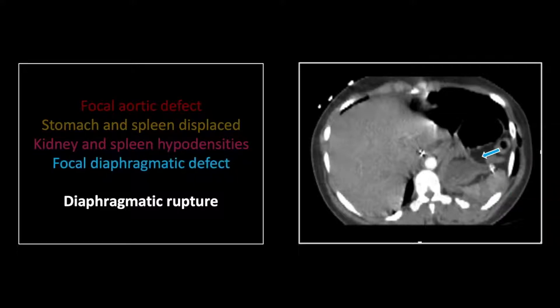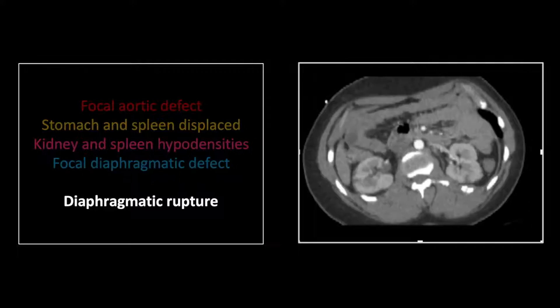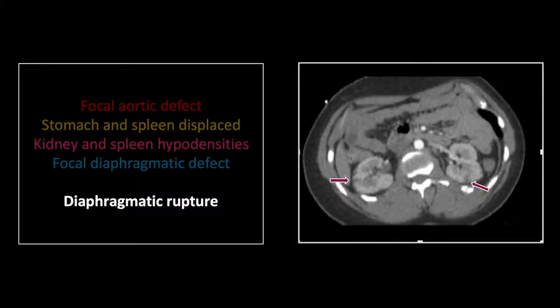There is also displacement of the viscera as they pass through the defect in the left diaphragm. The kidneys also demonstrate small wedge-shaped hypodensities consistent with thromboembolic infarcts — a very important indicator of a vascular injury.